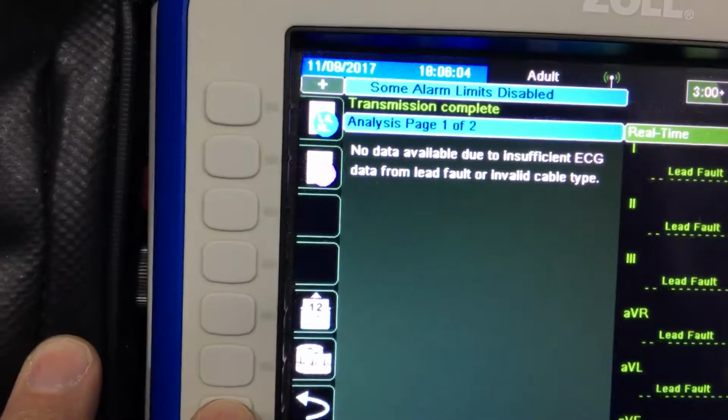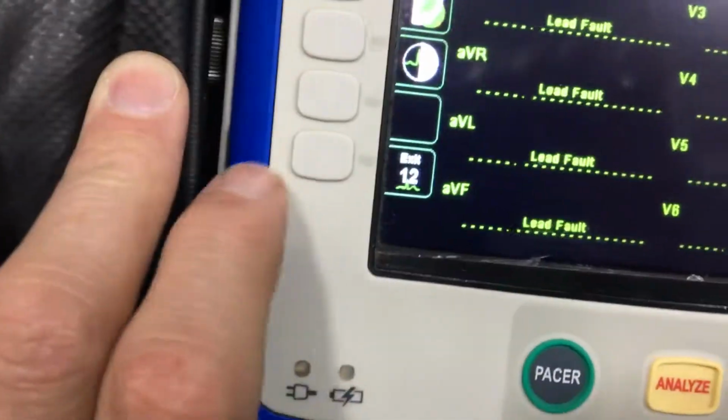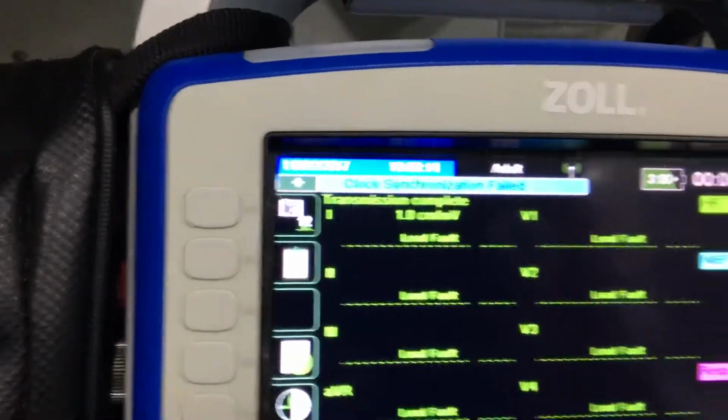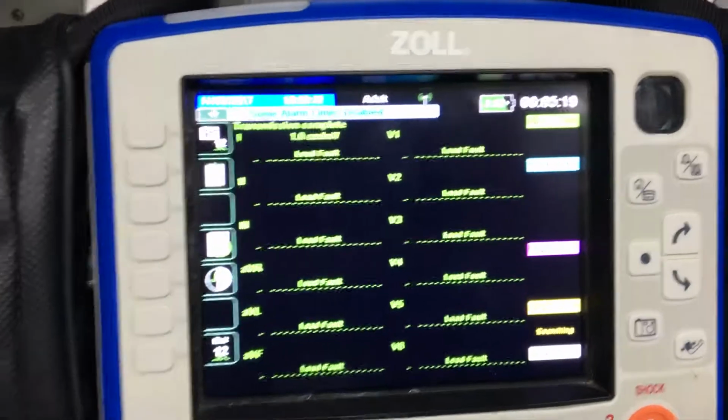So if you exit out of this screen right here, then you've lost your envelope. You can't get back to it without doing another 12 lead. So you can't go back and send a previous 12 lead. If you want to send one, you have to do another 12 lead.